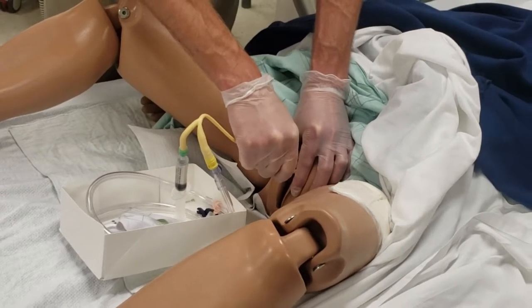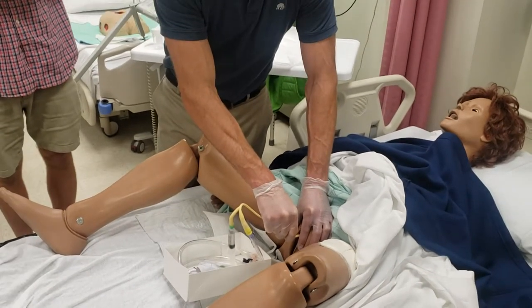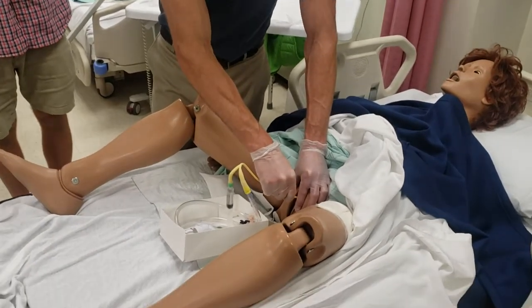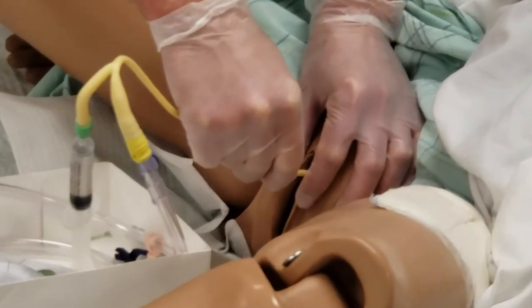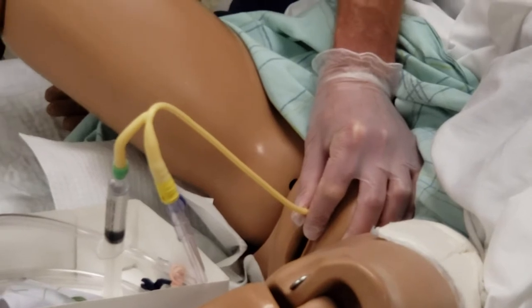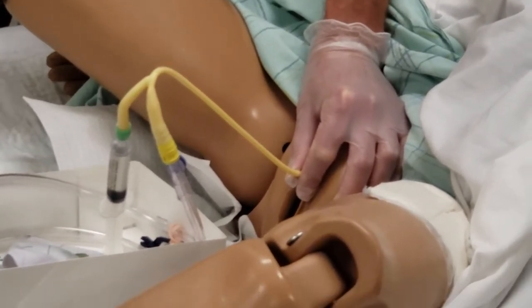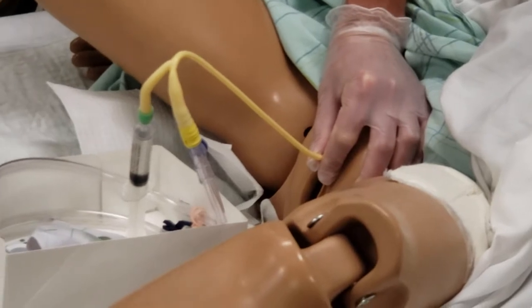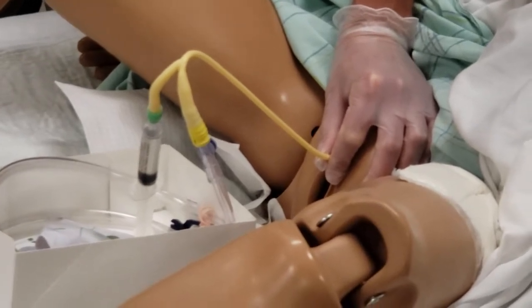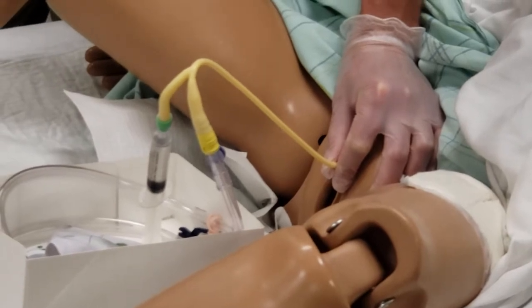It's not something I would judge you for. Once you're in one to two inches, you take your non-sterile hand — which is my left hand — grab the catheter and hold it. My left hand is contaminated on purpose; it's touching the outside of the catheter which is not going to go into the patient any further. It's going to be bouncing off her thighs or whatever it might be — so it's fine. Otherwise by the time I get to the syringe it'll spit out and I'll be at ground zero.